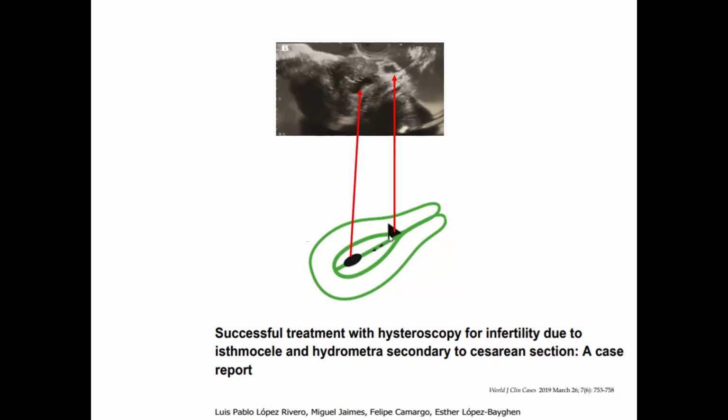The patient has two factors of failure, which are infection, chronic endometritis, and accumulation of the menstrual blood here, with retrograde spread to the implantation site.